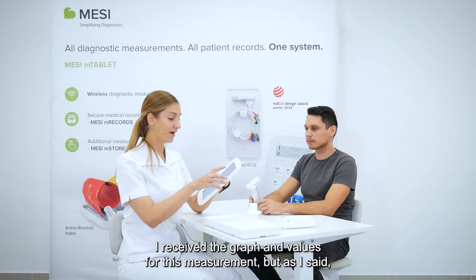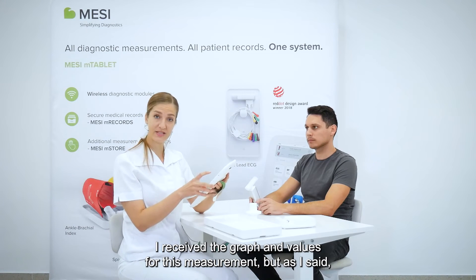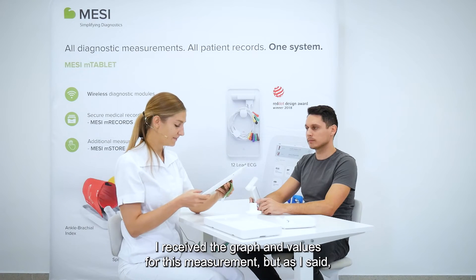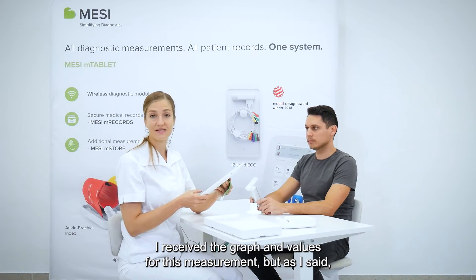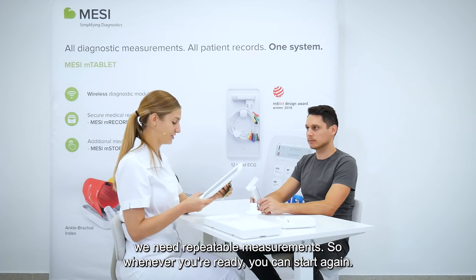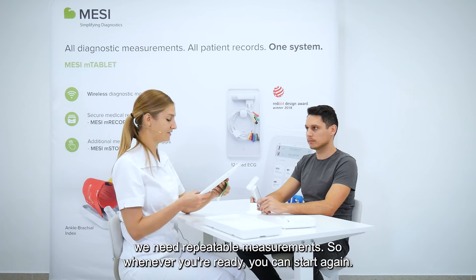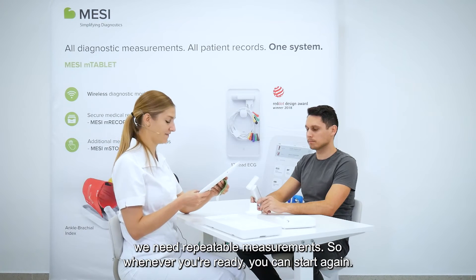I received the graph and the values for this particular measurement, but as I said, we need repeatable measurements. So whenever you are ready, you can start again.